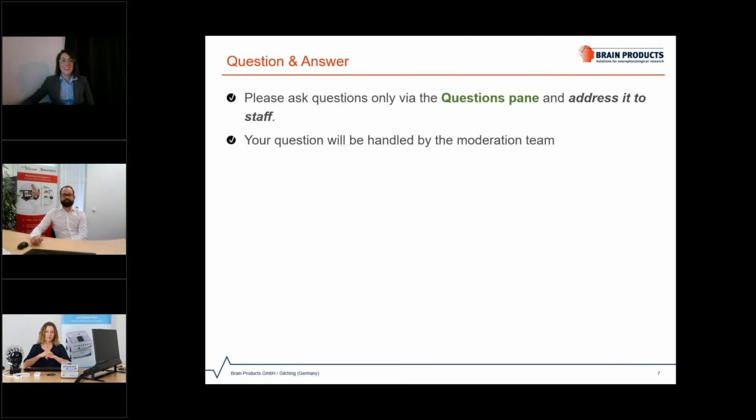Perfect, thank you. I have another question for Laura. Okay, we have somebody who's using E Prime. Can they still use that for eye tracking with the Spectrum?